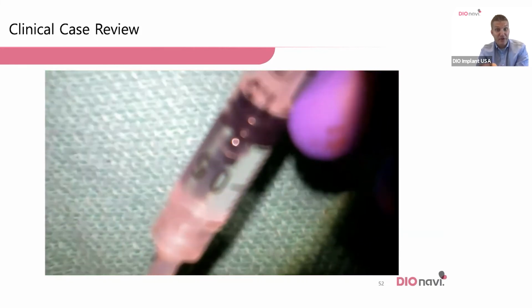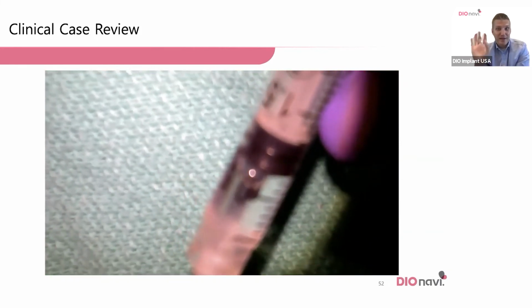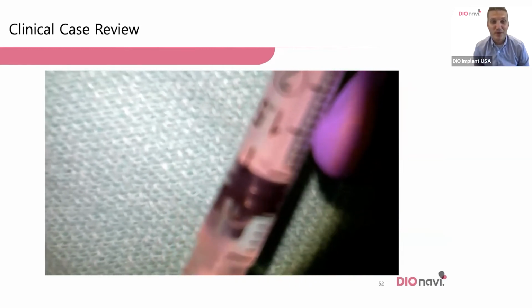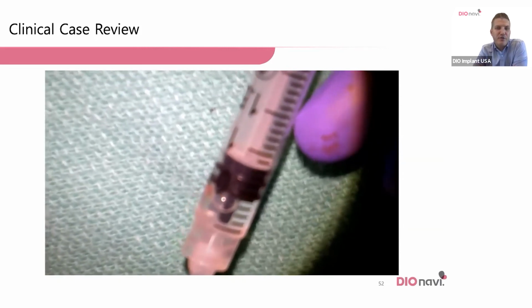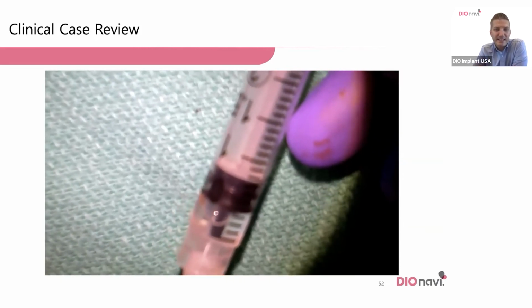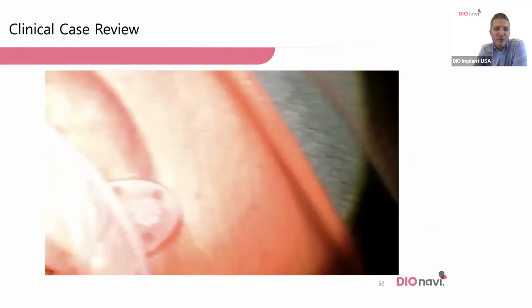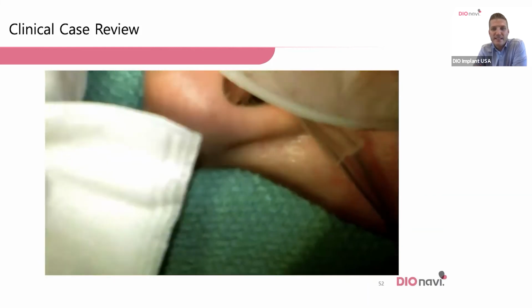And then that scared me right there. It kind of pushed through and I didn't feel any back pressure, but I didn't perf, thank goodness. But did you notice it kind of went a little bit quick there? And so now I'm just slowly pushing, getting to about 0.6 cc's. That's what my drilling protocol recommends. I went a little bit more than that. I like at least 0.8, maybe even 1 cc of total volume.